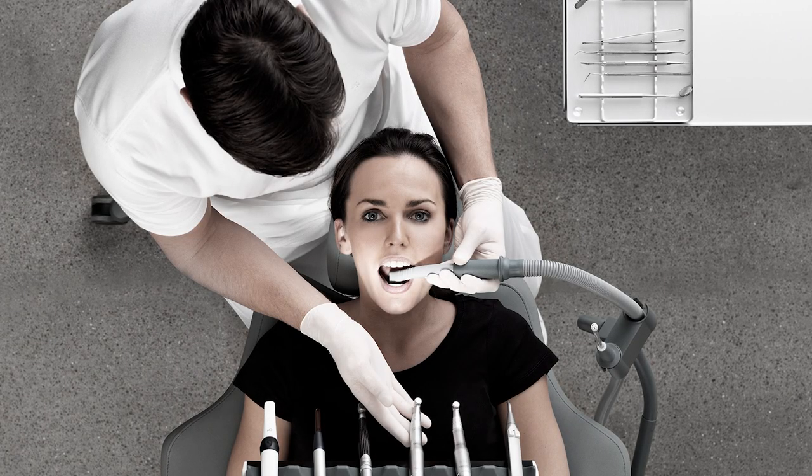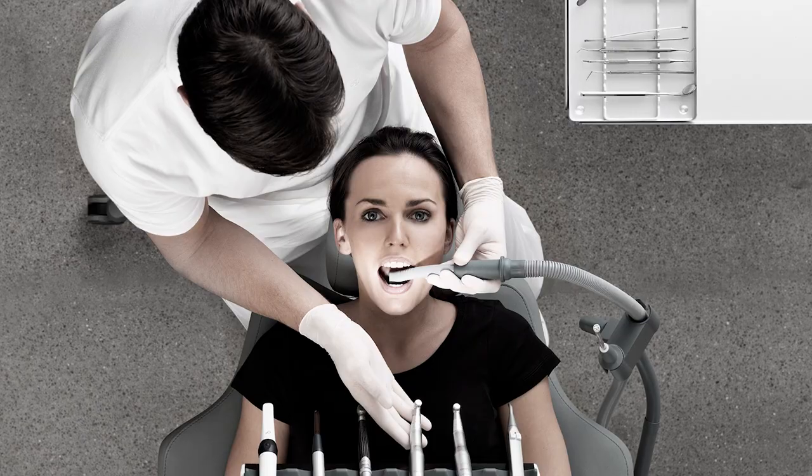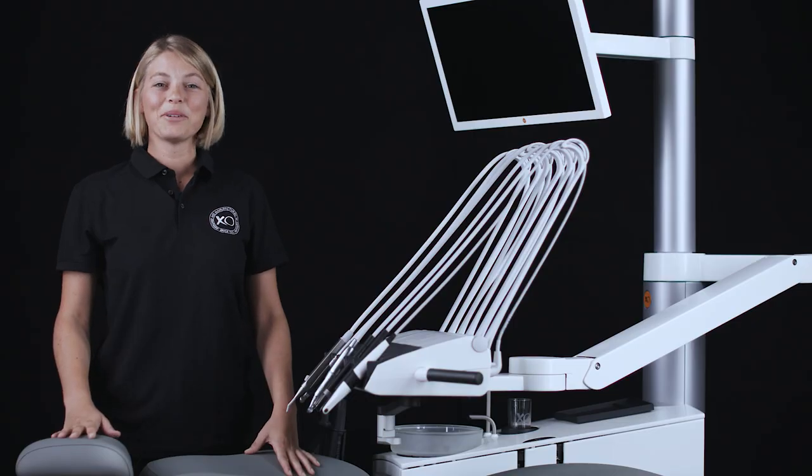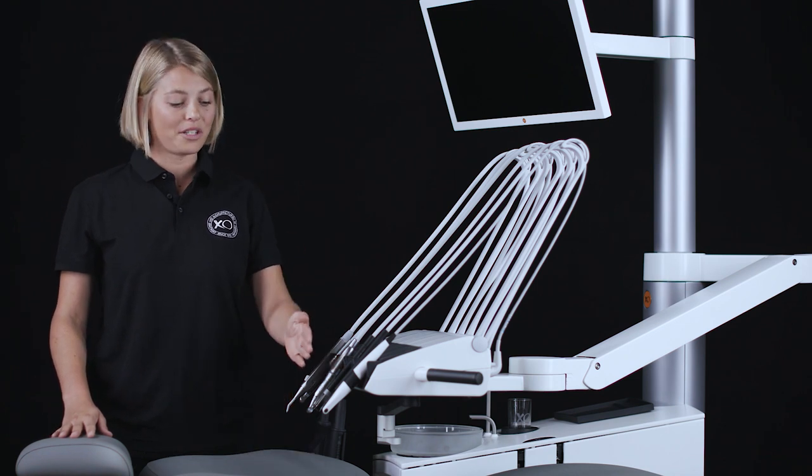Two-handed operation: here the operator is working in the 11 o'clock position. To obtain easy access and optimal balancing of the instruments, place the instrument bridge close to the center of the patient's chest with a distance from the tips of the instruments to the oral cavity of 30 centimeters.